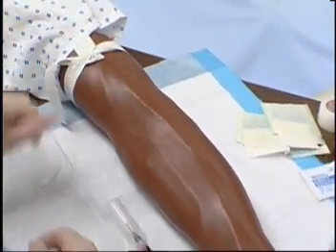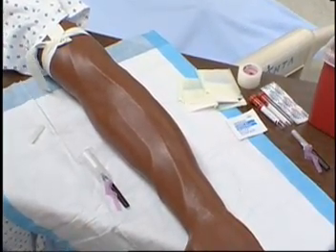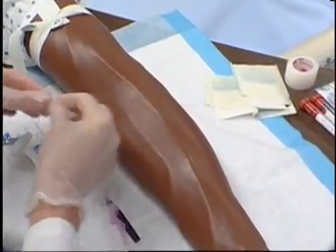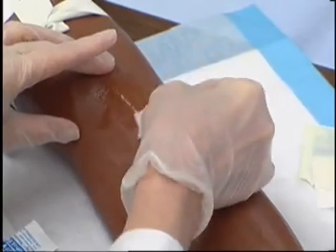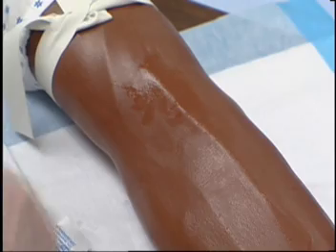Tighten the tourniquet and have client open and close fist. Cleanse the site with alcohol or antimicrobial wipe, starting at the vein site and moving in a circular motion about two inches away from the vein. Let site dry.